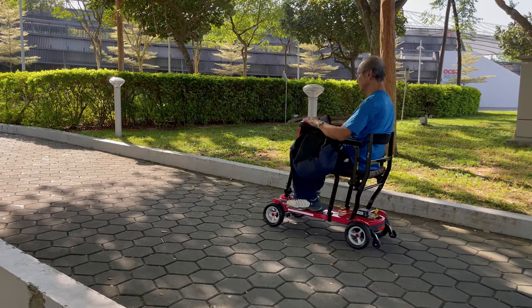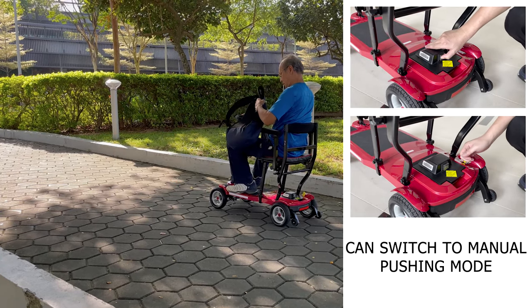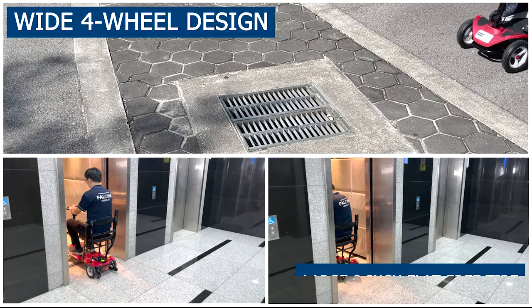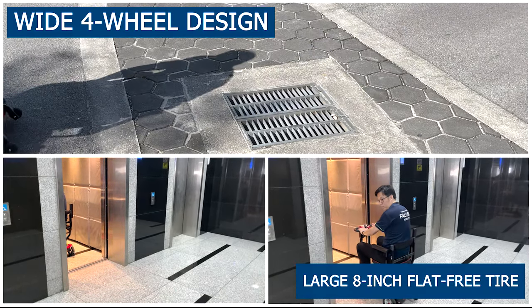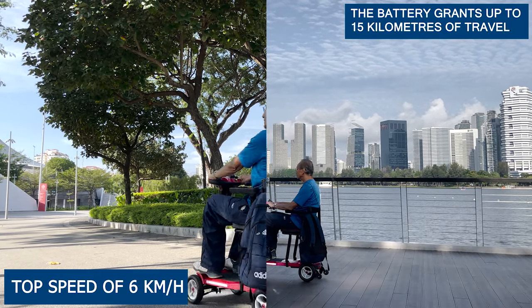Safety is a top priority, boasting exceptional control and braking capabilities, providing you the ability to brake completely on slopes. By simply setting the brake levers to the neutral position, you can switch to manual pushing mode, ensuring complete control and safety in any situation.